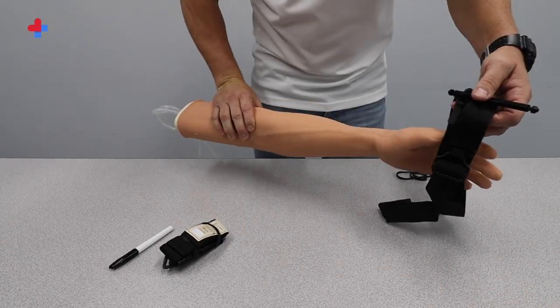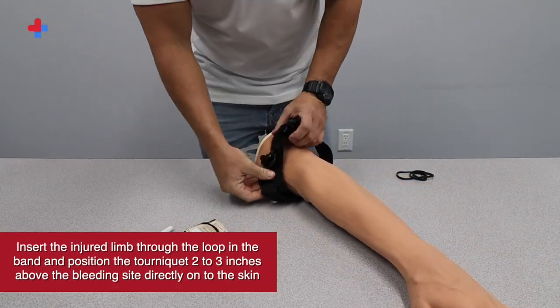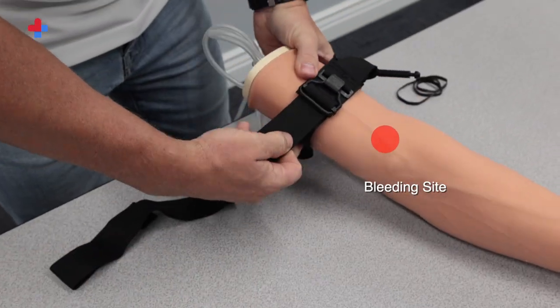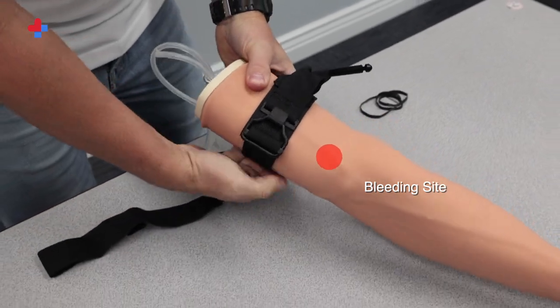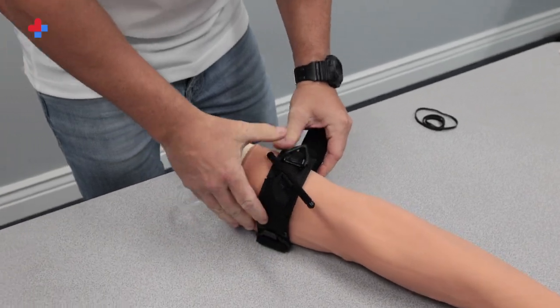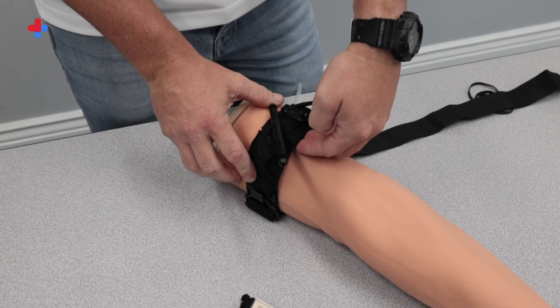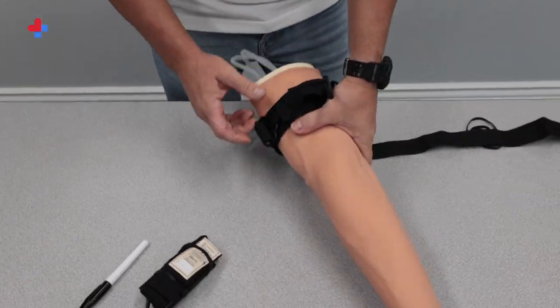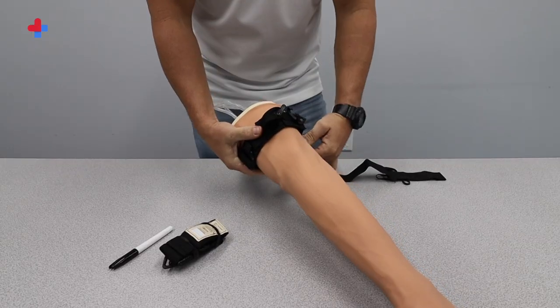To apply the tourniquet, insert the injured limb through the loop in the band and position the tourniquet two to three inches above the bleeding site, directly onto the skin. Pull the band tightly and fasten it back on itself all the way around the limb, but not over the rod clips. The band should be tight enough that the tips of three fingers will not fit between the band and the limb. If your fingertips fit between the band and the limb, rewrap the band more tightly and check again.